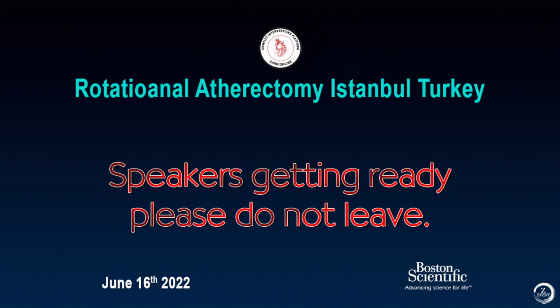Excellent. Very great summary of complications and how to deal with them, and as importantly said, how to avoid them too. We'll move on to Professor Nihat Kalay. Do you want to go ahead and present your IVUS talk?